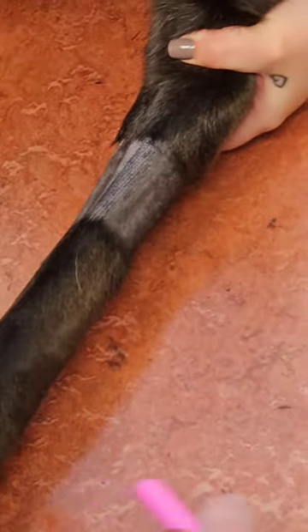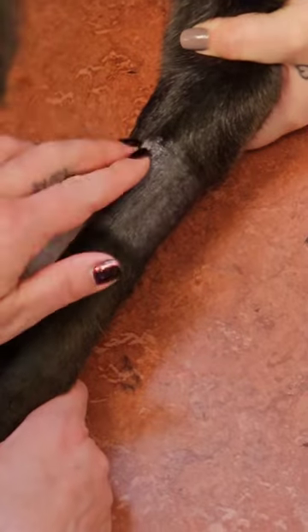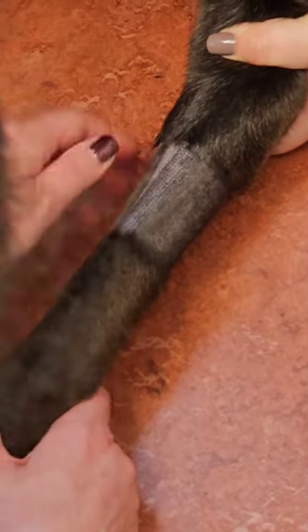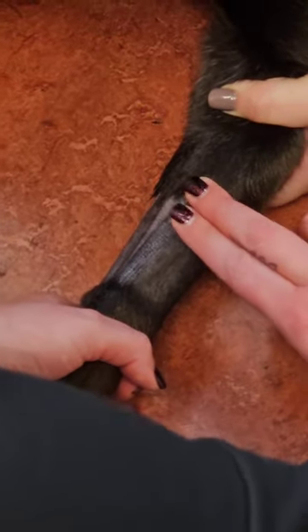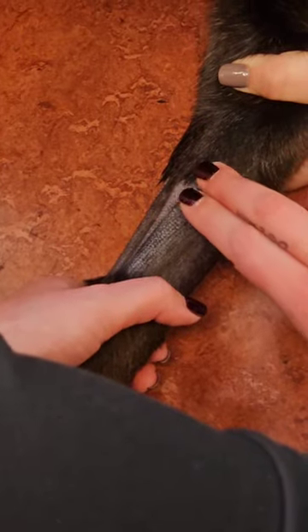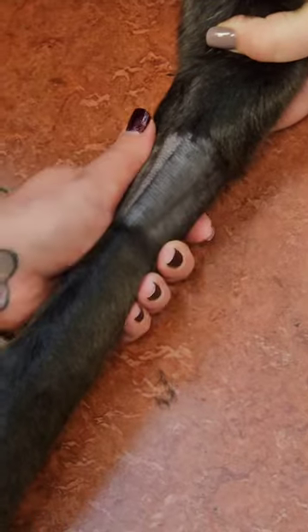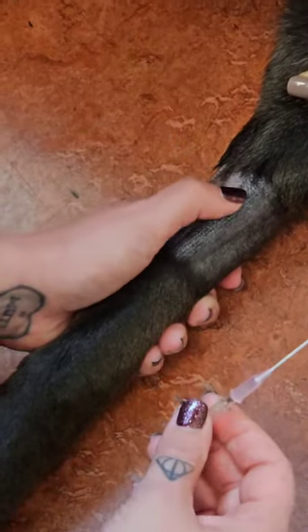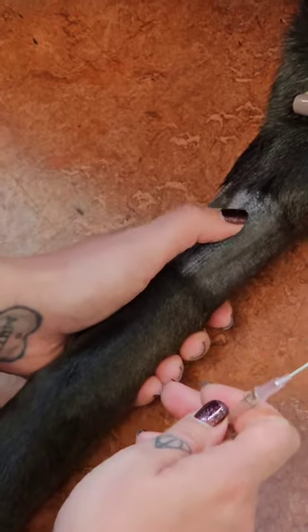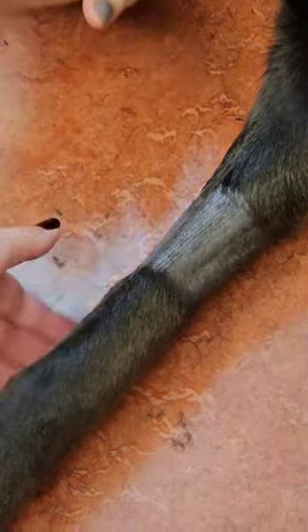This patient's leg is already shaved for placement of an IV catheter in the cephalic vein. We generally shave all the way around — that helps when taping to make it easy to also remove, so we're not yanking on a ton of hair, and it keeps it cleaner to be able to clean that whole area. The leg has already been scrubbed alternating between chlorhexidine and alcohol — chlorhexidine a couple times, then alcohol, back and forth two to three times.